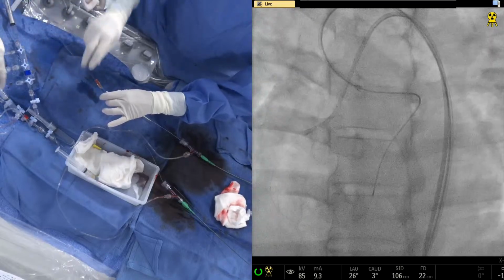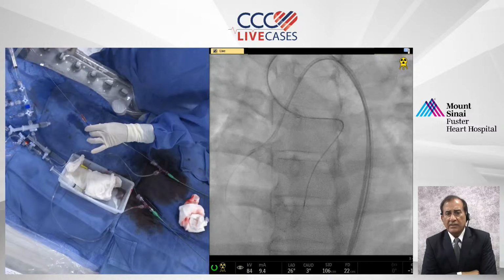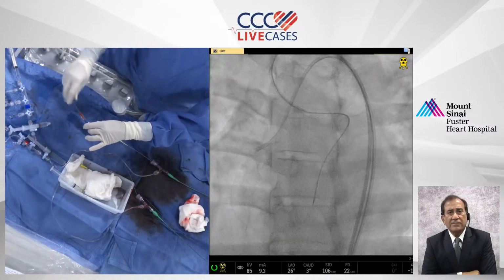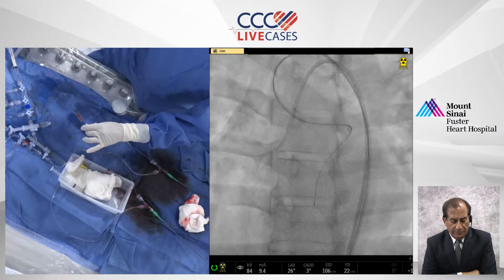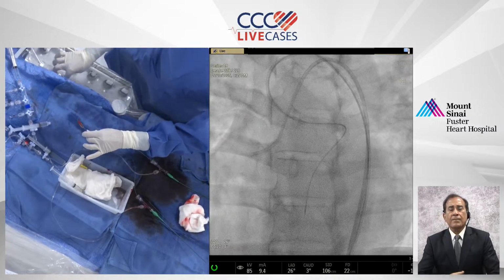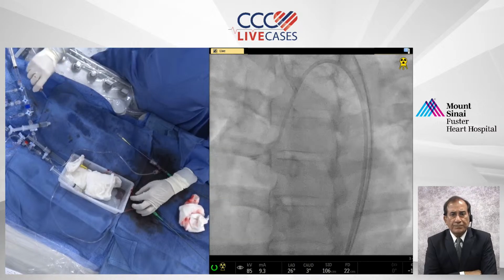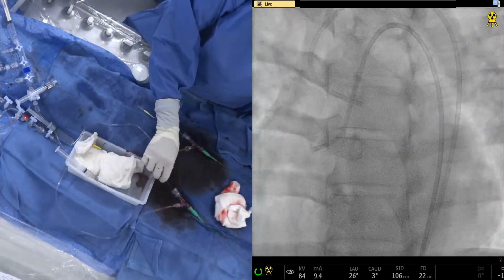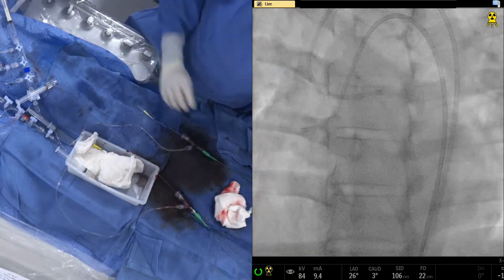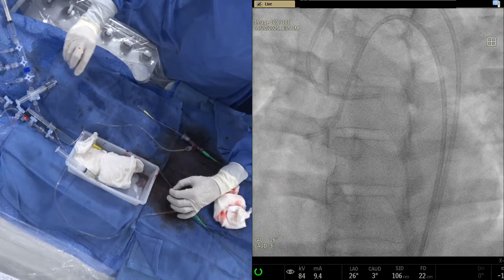The exactly same case in an older person with more calcification would have been an altogether different ballgame. Absolutely. Calcium is the biggest issue, particularly with the CTO. That one was an issue. They wanted a safety wire there. But anyway, that's not the thing. I think this came out.